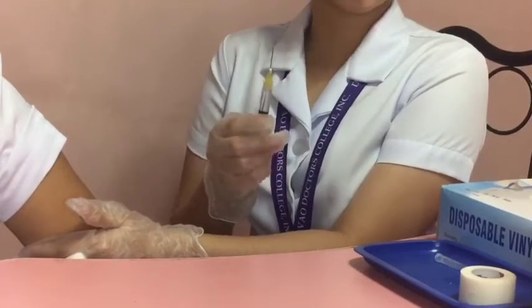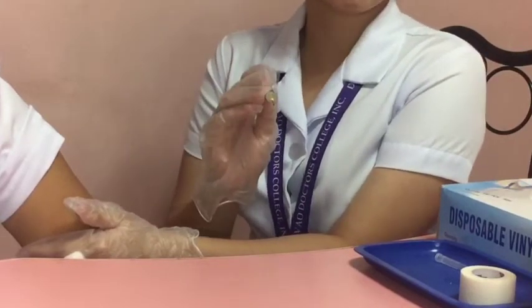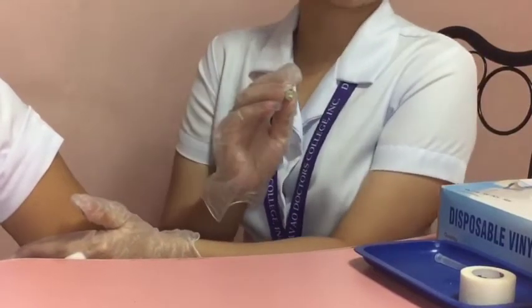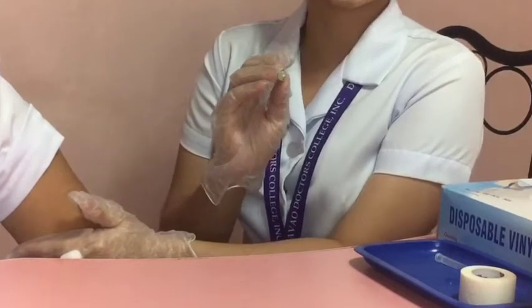Hold the syringe between the thumb and forefinger as if you are holding a pen, and pierce the skin quickly and smoothly at about a 90-degree angle. After inserting the needle, use a quick motion to lessen the client's discomfort.